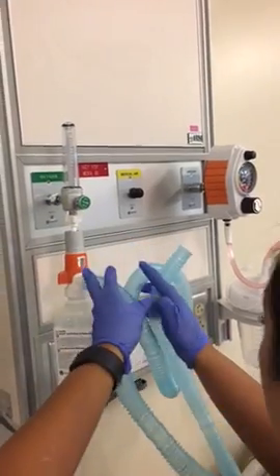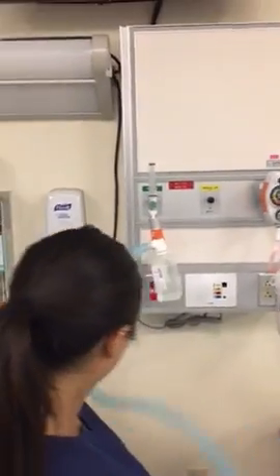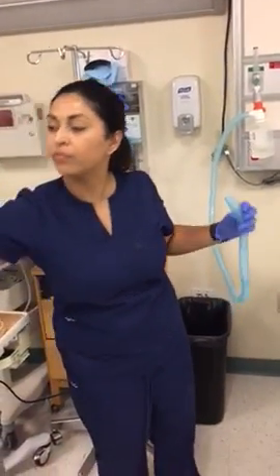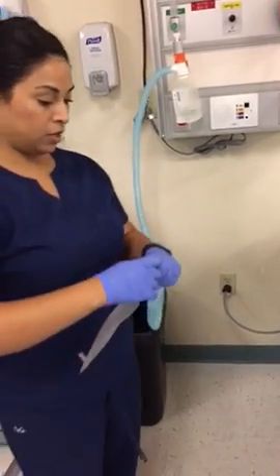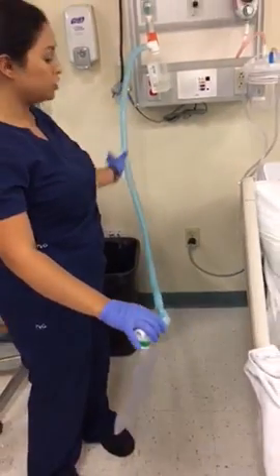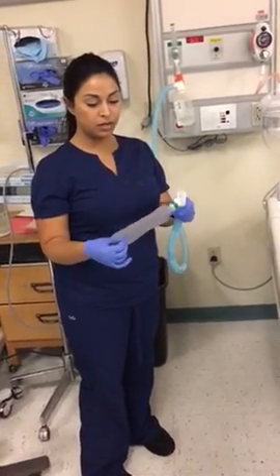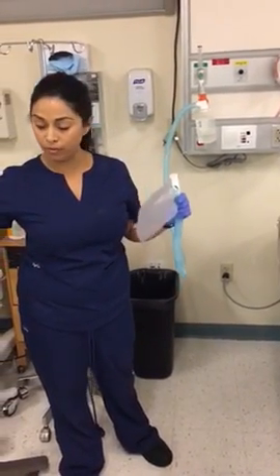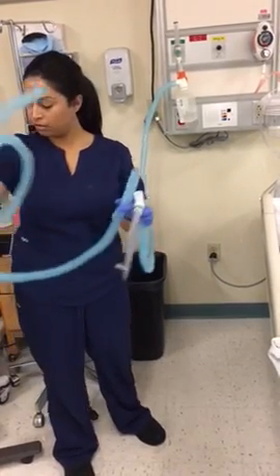Just making sure it's tight enough. Next we can get the water trap ready. You want the water trap to be at the bottom of the bed, that way the condensation can collect into this bag. If the patient's on humidity for a while, you want to change out these bags periodically if they're full. So I want to be very careful.